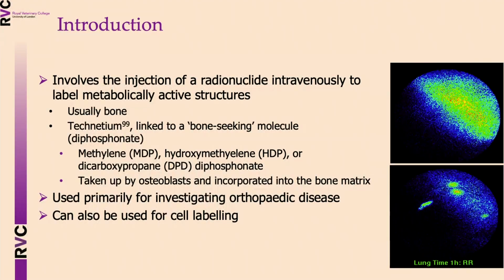We use technetium-99 as the radioactive label, linked to a bone-seeking molecule, which is a diphosphonate.